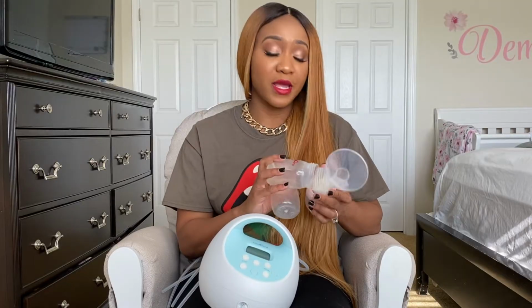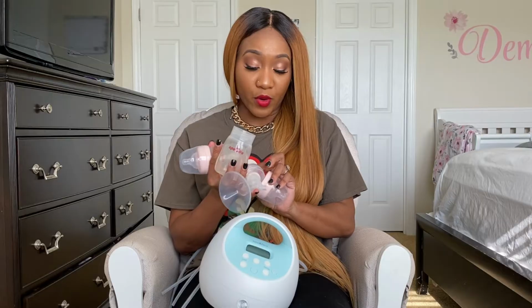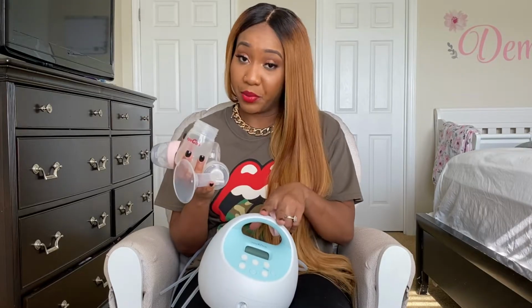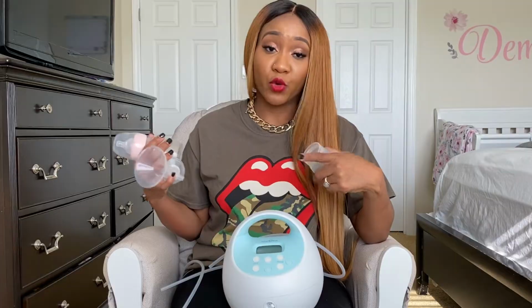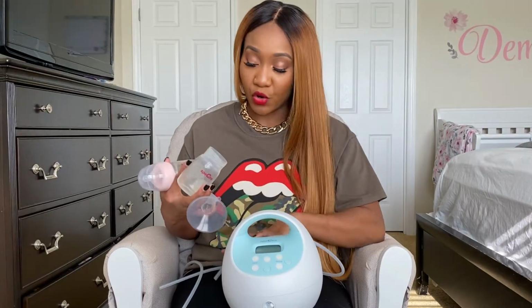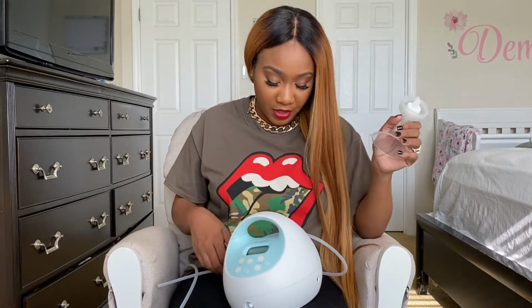It is so important that when you get all of these, you're gonna want to boil everything, not the pump, obviously. Now y'all, I gotta say it, set these in boiling water for 5 minutes. It's important that you don't do any longer because you can ruin these if you boil it for longer than 5 minutes. I did see on Amazon they got the cute little bags and coolers and stuff. You definitely want to get that.